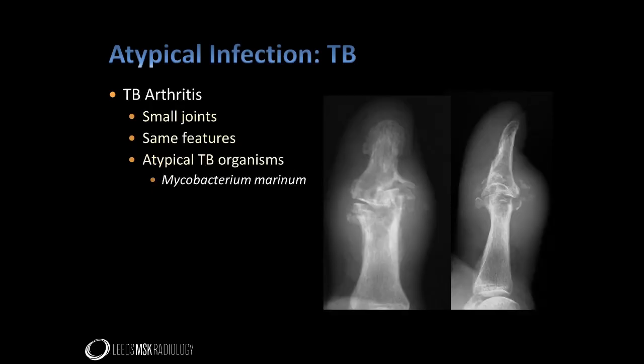Similar features are seen with mycobacterium affecting the small joints, as in this interphalangeal thumb joint. Note the severe bone destruction despite the preservation of joint space. There is also periarticular soft tissue calcification evident. This is an example of a well-recognised atypical mycobacterium infection carried by fish — mycobacterium marinum. Involvement of the hands is typical, the infection gaining access to the body through open wound contact with contaminated water, fish bites or injury with contaminated marine or angling equipment.